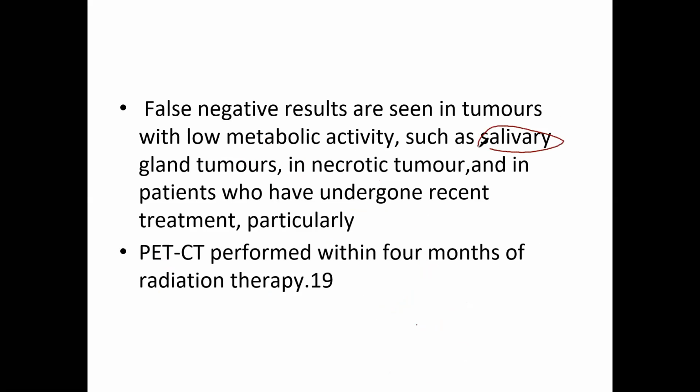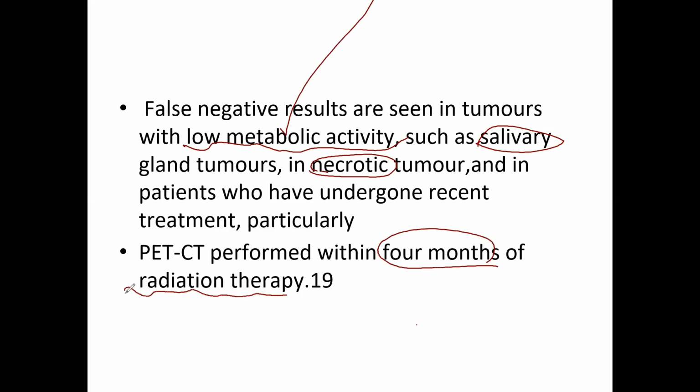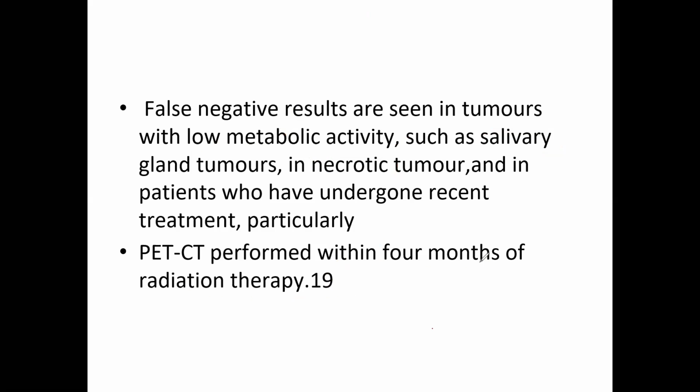Salivary glands are not of much use, and also in the necrotic gland, very low metabolic activity will be there. So there is a low metabolic activity, so it is not very much useful, especially within 4 months of radiation therapy. So you will have nothing much of use in this particular situation. So after recent radiotherapy, PET scan is not much useful. So keep that in mind.